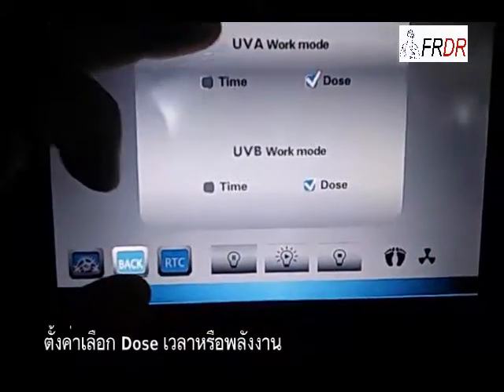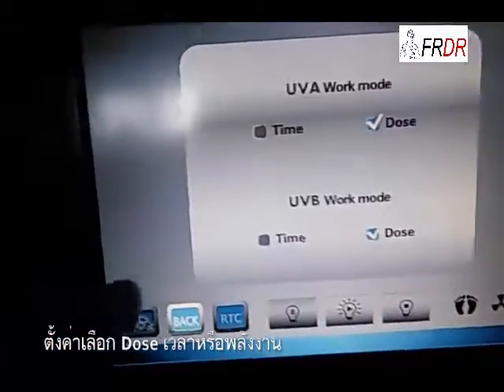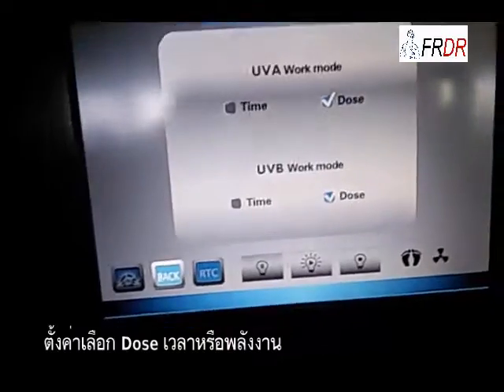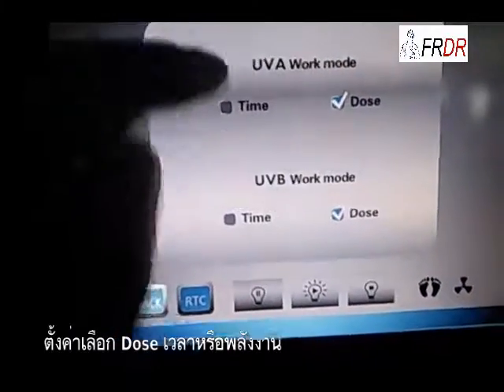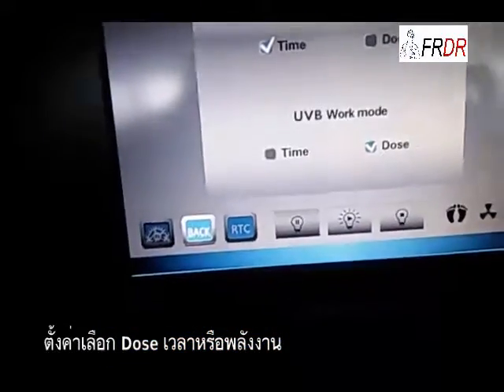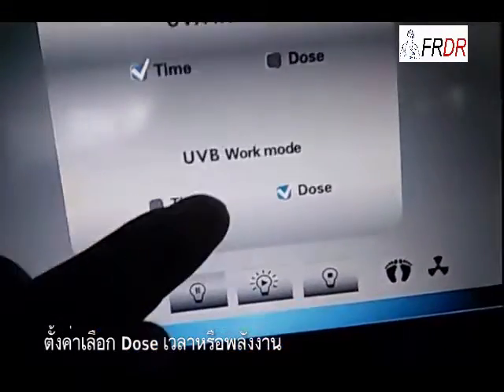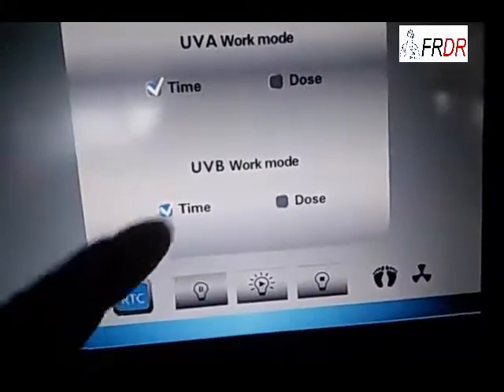By pressing here, we can choose UVA or UVB. This machine can run in DOS mode or time mode. If we choose DOS, then when we start the treatment, we can input a nominated dosage for this machine. But when we choose time, we can just input time, maybe 40 or 45 seconds for a single treatment. Since this machine only has UVB lamps, I'll show you how to operate in time mode.